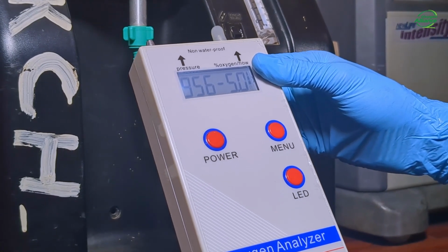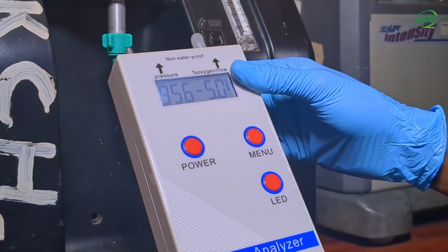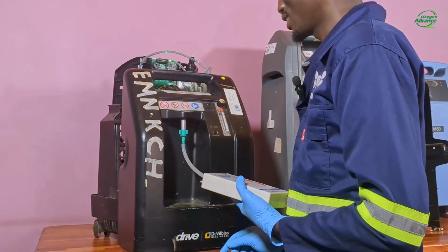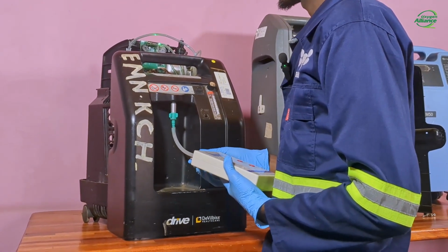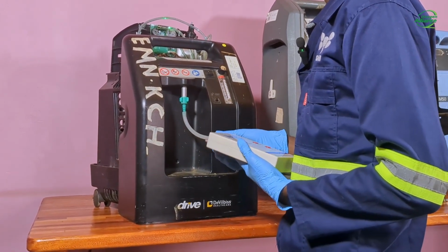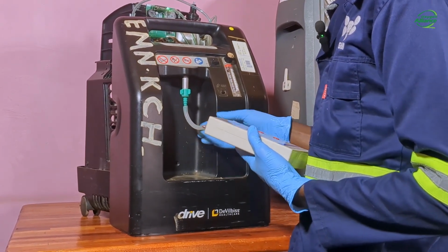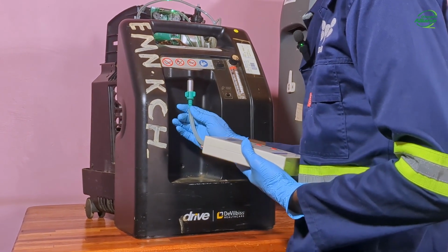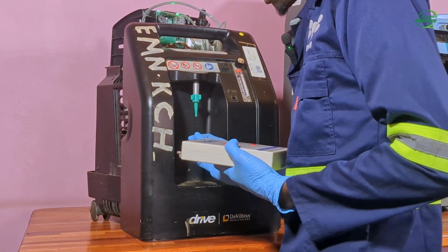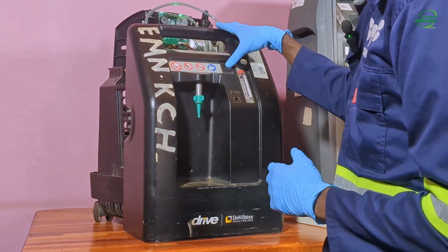So as you can see, the analyzer is showing a purity of 95.6%, which means that the loose connection on the board was contributing to the service alarm. So after going through the first problem, which is loose connection of the wire harness on the board, I will now take you through the other problems that you might experience with the valve. So I will just disconnect the analyzer. And then I will switch off the unit.